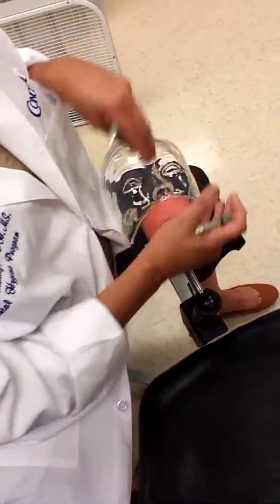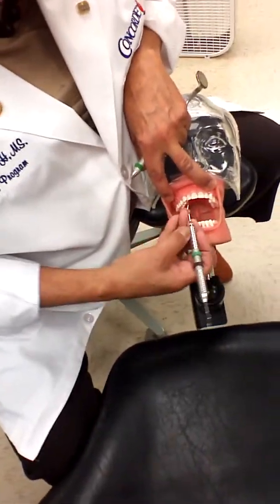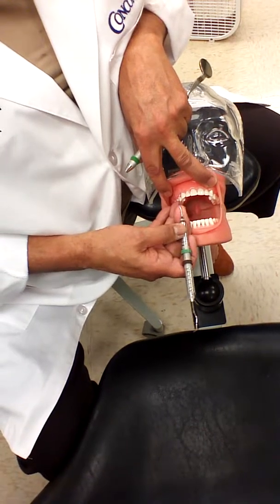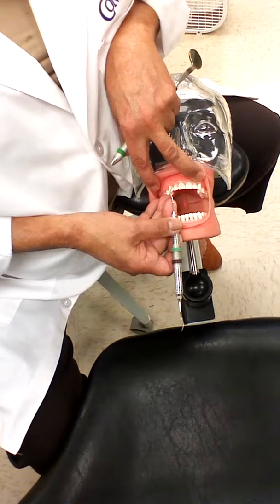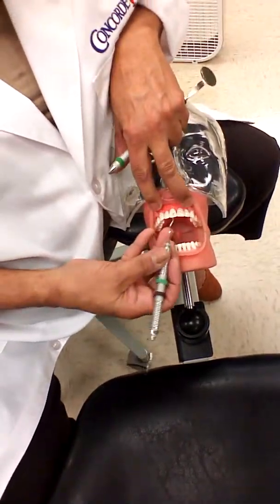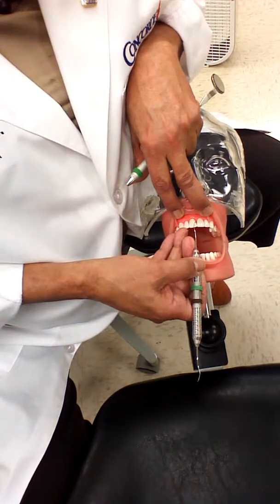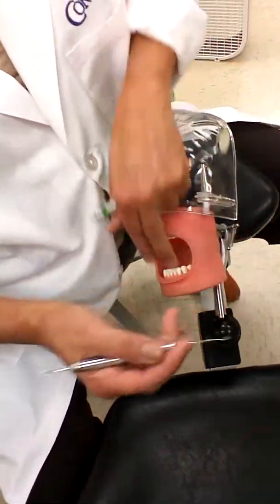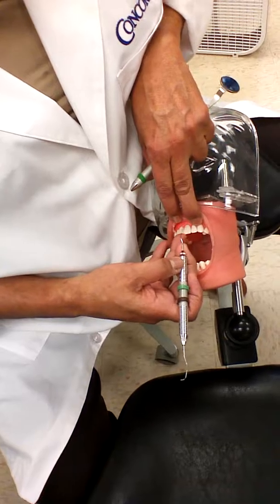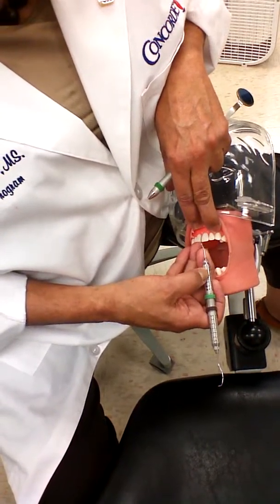Okay, now I'm going to go here, starting on number 6, do my surfaces away. Okay, and I think I want to have the same hand, actually. Okay, red line. Let's see, my instrument is parallel. And I go. So, don't want to be moving. You don't want to be changing positions when you're up in the middle of a focus or a stroke. You always stay.